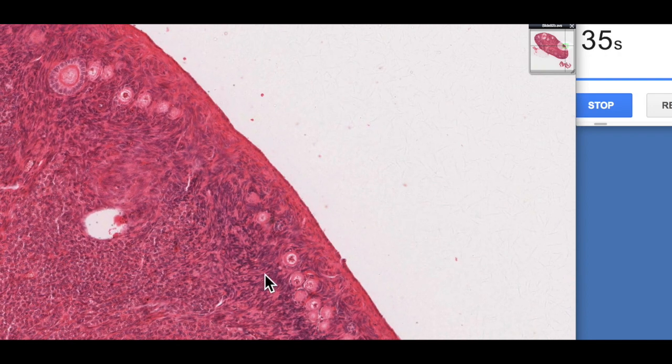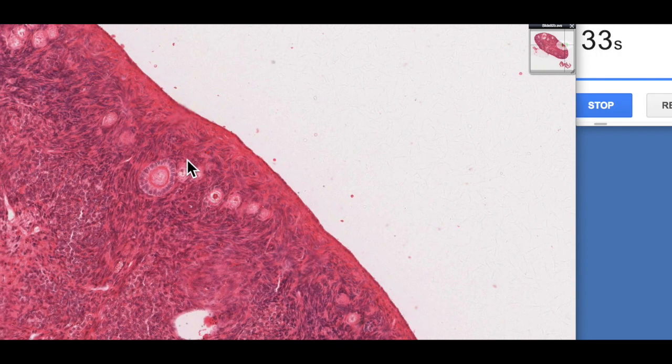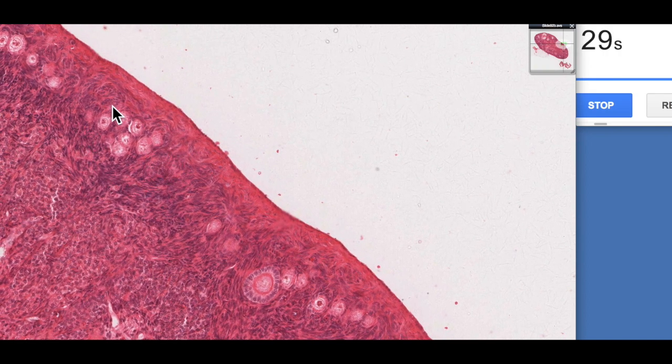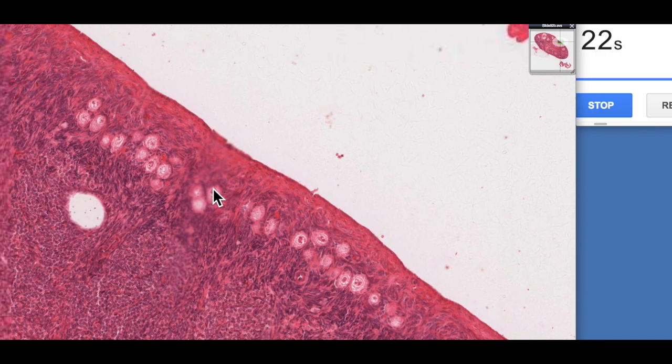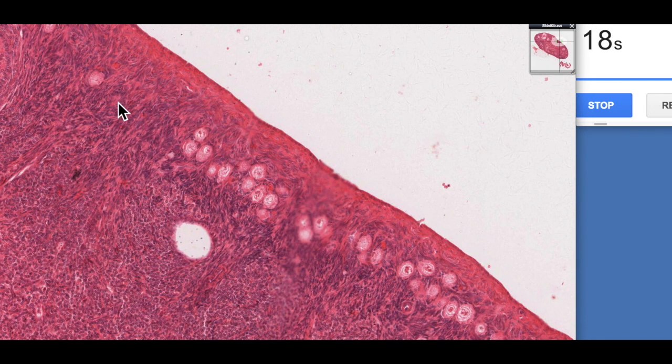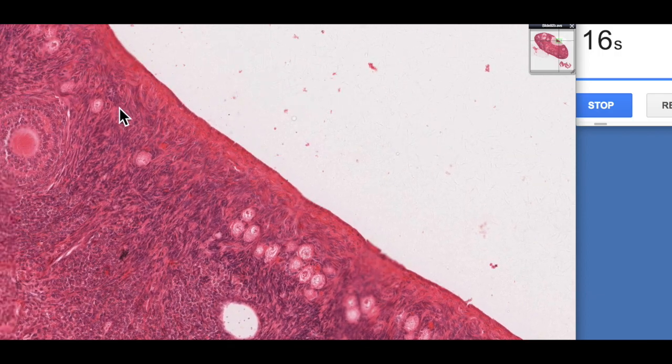If we zoom out a little bit, we can see these follicles at various stages of development, and then the tissue in between the follicles is referred to as stroma. So the cortex contains follicles at various stages of development, and then stromal cells in between, and there's capillaries and other blood vessels supplying these follicles here.